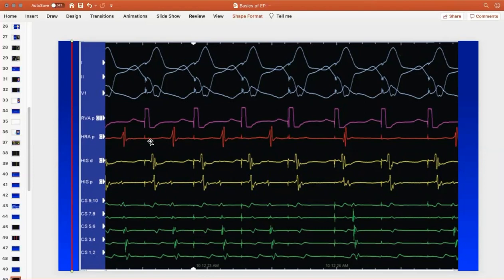So you see at the beginning a stimulus, and you have an A, then a stimulus, you have an A, and a stimulus. Stimulus and the A. Stimulus. But there is no A. Yes. We'll talk about this A. But what do you think? If you think about these tracings, you have more than one component. So here, you're pacing and you're conducting to the A. So you probably can have an idea whether you have a normal conduction or not.